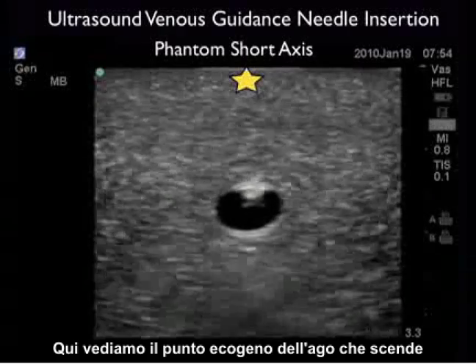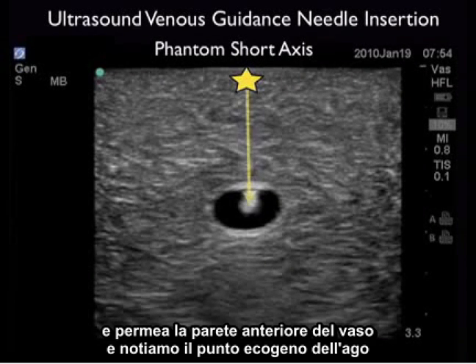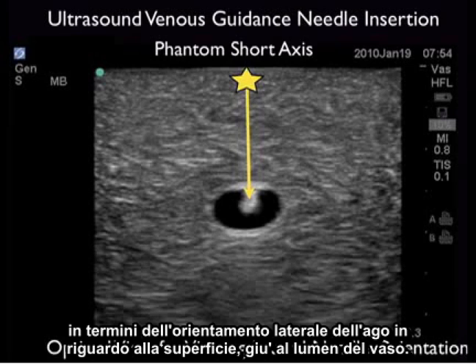Here we see the echogenic tip of the needle coming down and permeating the anterior wall of the vessel, and we then note the echogenic tip of the needle squarely inside the lumen of the vessel. We can see how using the short axis orientation can guide us in a side-to-side orientation on the patient's neck in terms of lateral needle orientation with regard to the surface down to the vessel lumen.